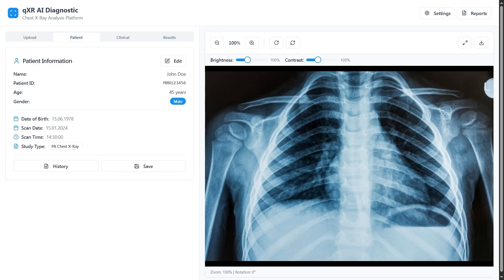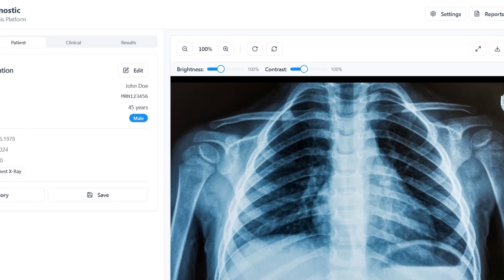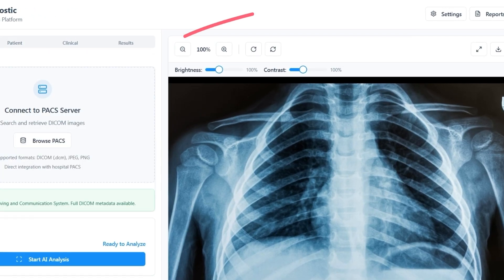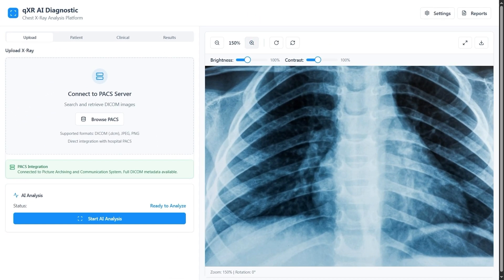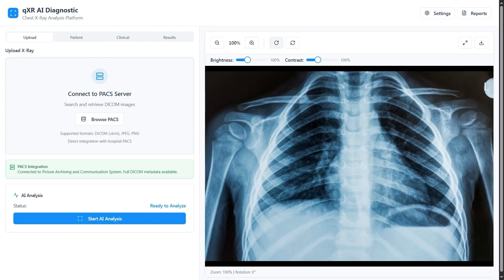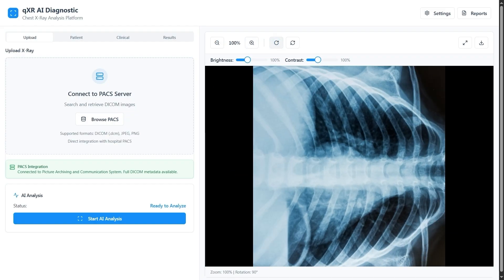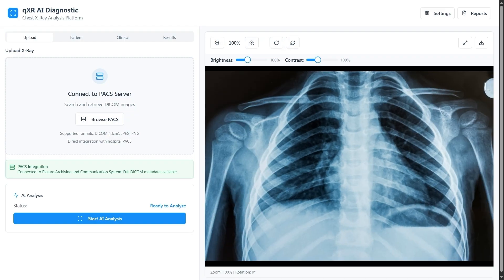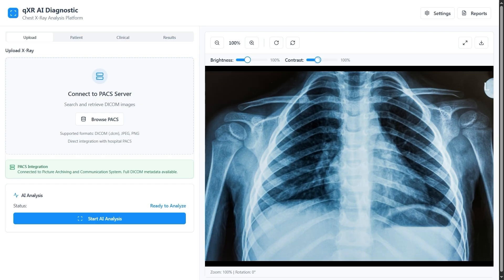For preliminary image examination, zoom and rotation are available. It's also possible to adjust brightness and contrast to enhance visibility.